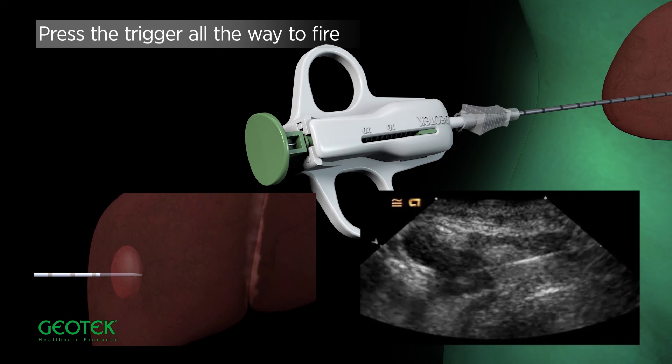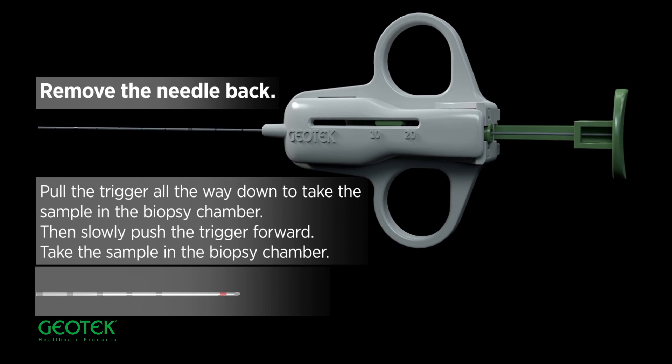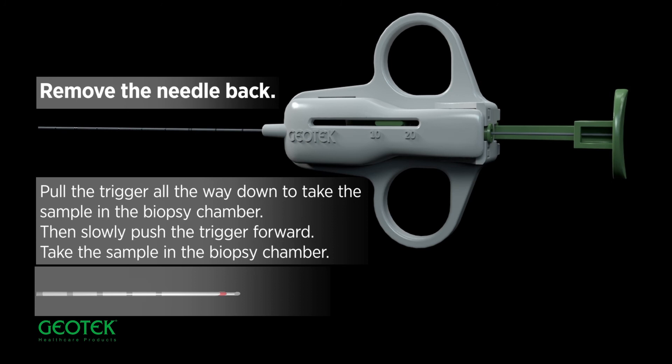Press the trigger all the way to fire. Remove the needle back. Pull the trigger all the way down to take the sample in the biopsy chamber. Then push the trigger forward. Take the sample in the biopsy chamber.